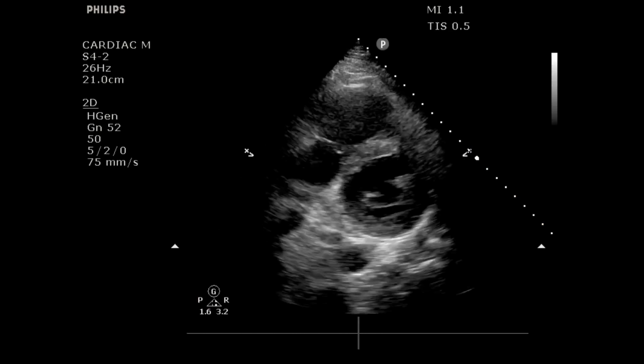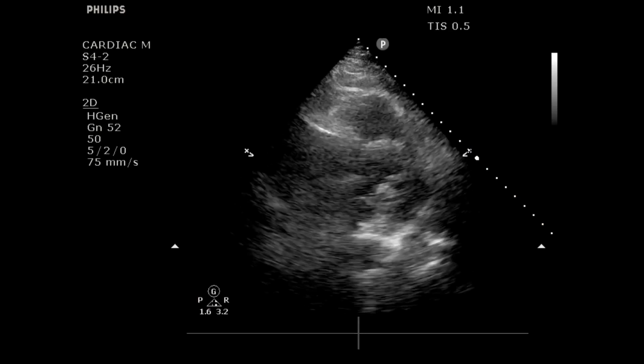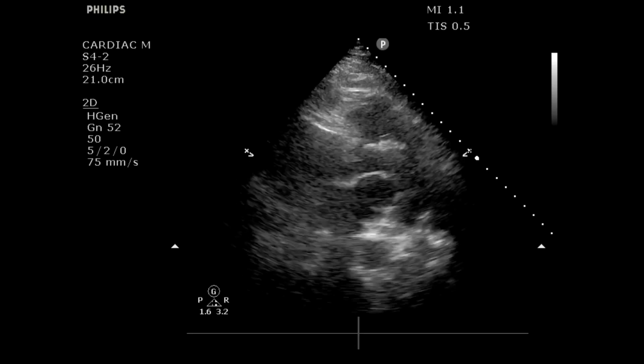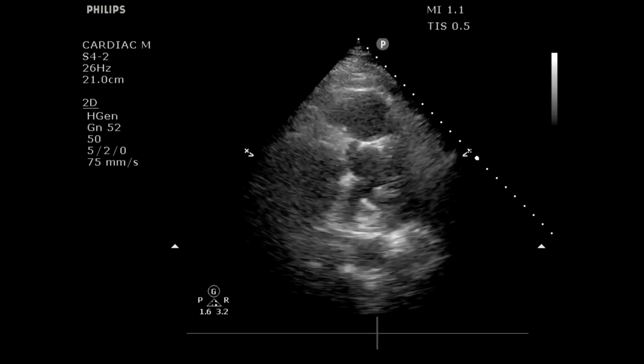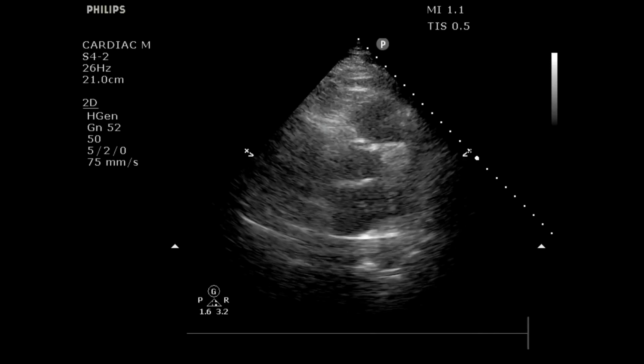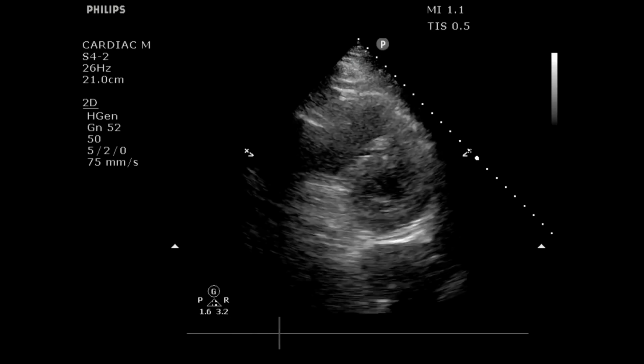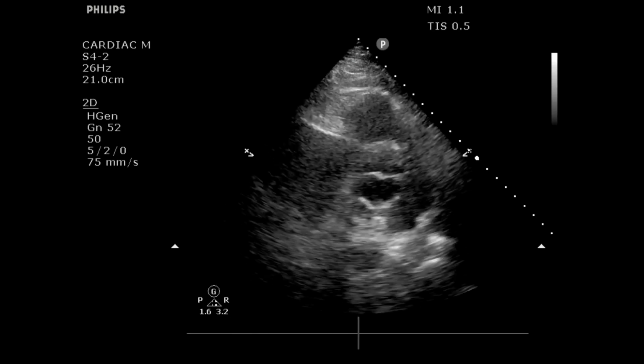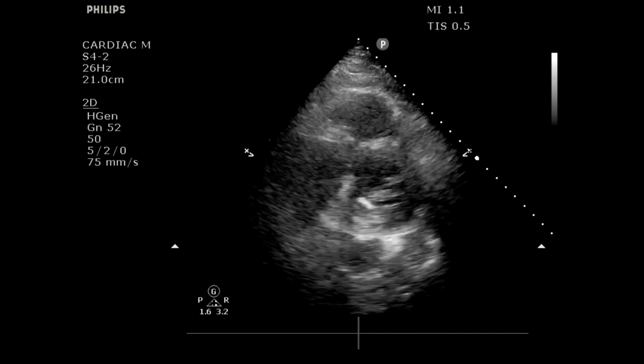So if we go to the parasternal short, right, we're going to look for basically roundness of the ventricle, see if there's any flattening. And I don't really see any flattening of that RV, or the septal wall into the RV, right? Maybe a touch, but it could just be the angle that we have, right? The RV looks a little bit big.